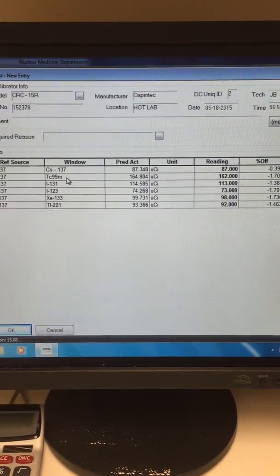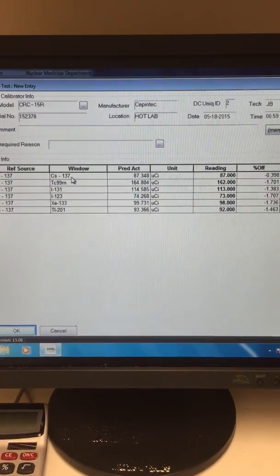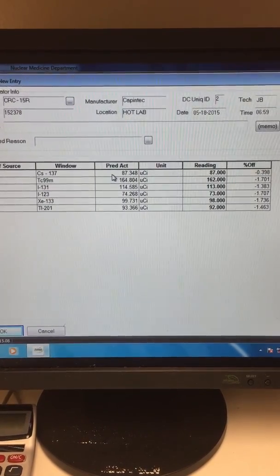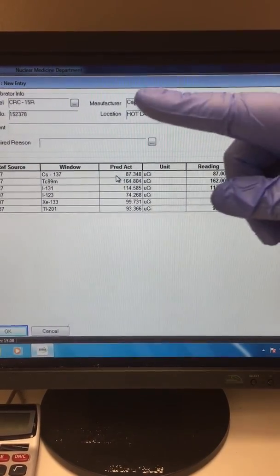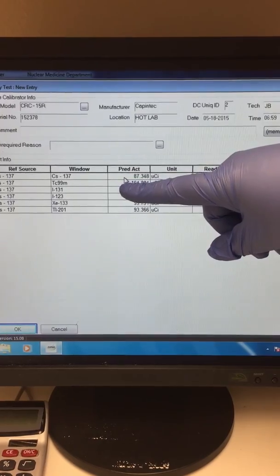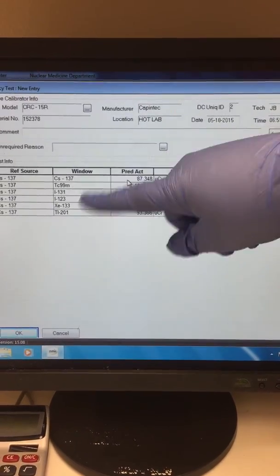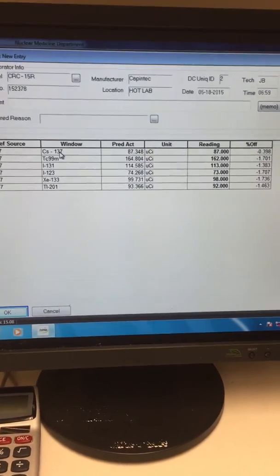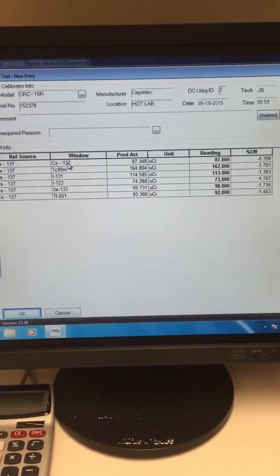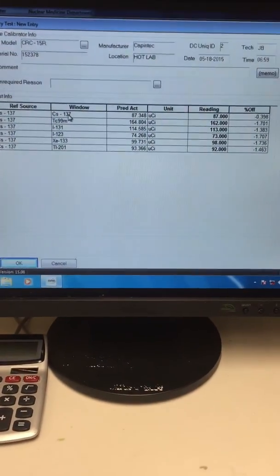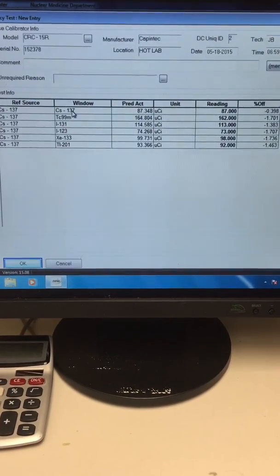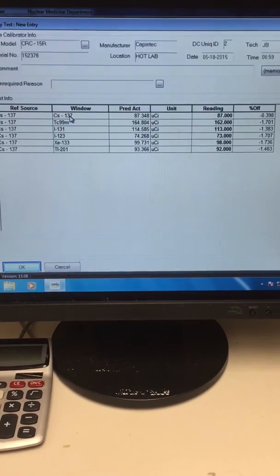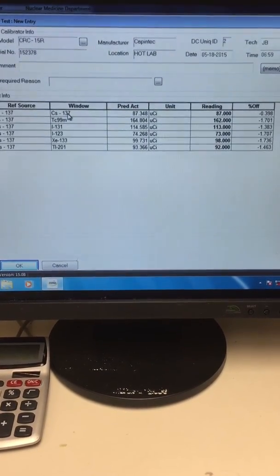So we base all of these readings off of our cesium-137 source. And based on that source activity, we get the target activity of each isotope channel. And the reason we like to use this source is because it has a long half-life of 30 years. So it decays very slow. So it has a constant, pretty constant activity. So it's good for a constancy test.